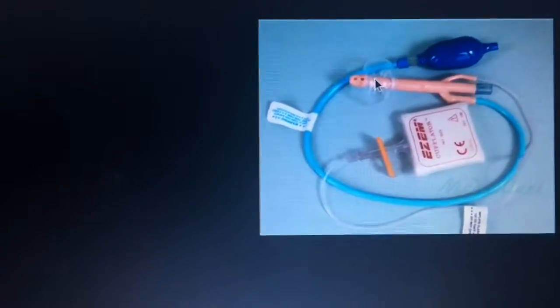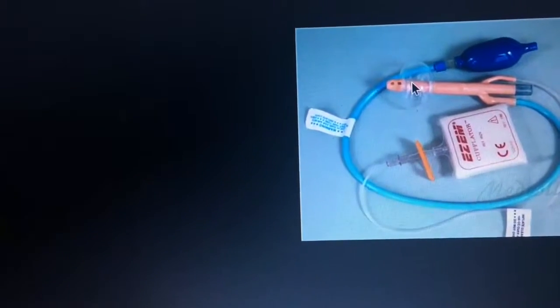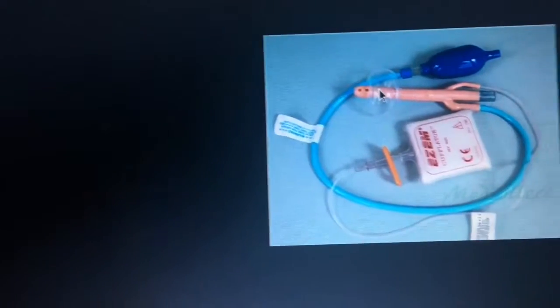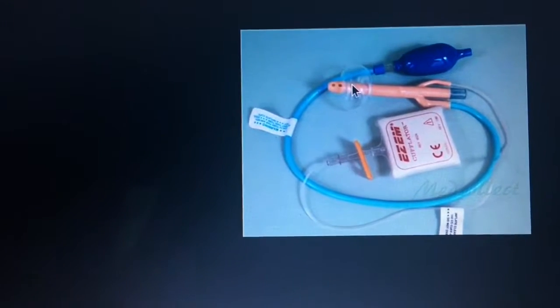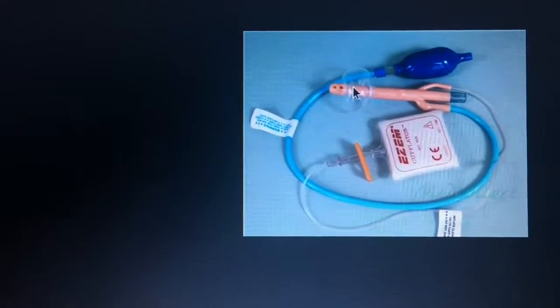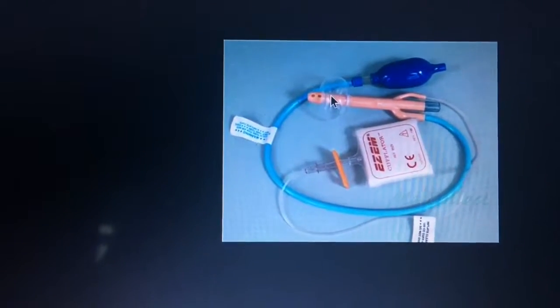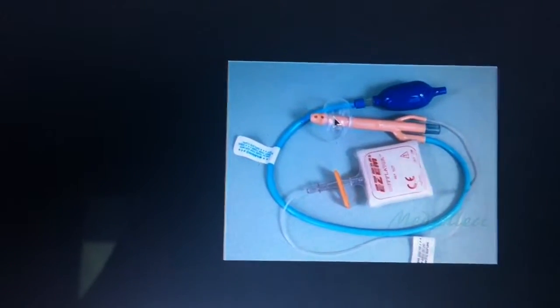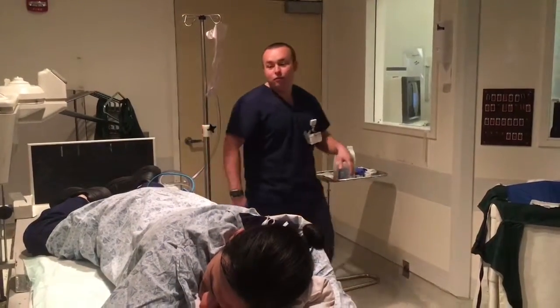Once the tip's inserted into the patient, like I said, no further than 4 inches. You're going to go anterior superiorly. You're going to have the patient take a deep breath, blow out, and then you're going to insert. You're going to inflate the balloon, anchor it in, get the radiologist. The radiologist will start the retrofilling, apply air with the bulb. He'll take his pictures, and then we'll do our other images overhead.